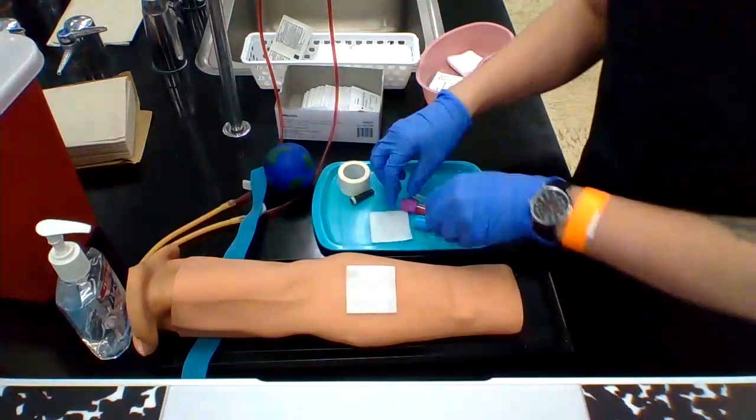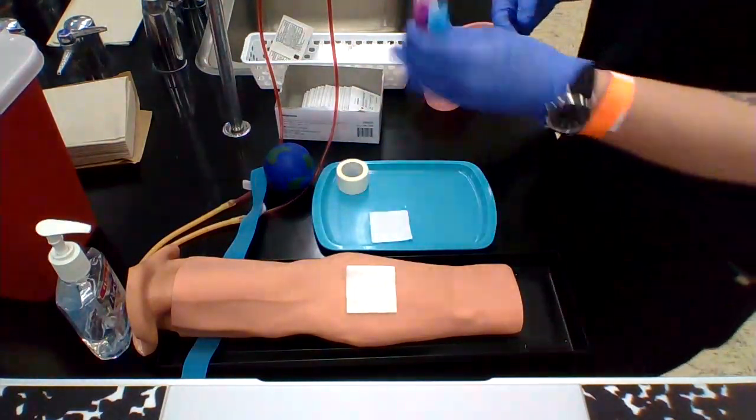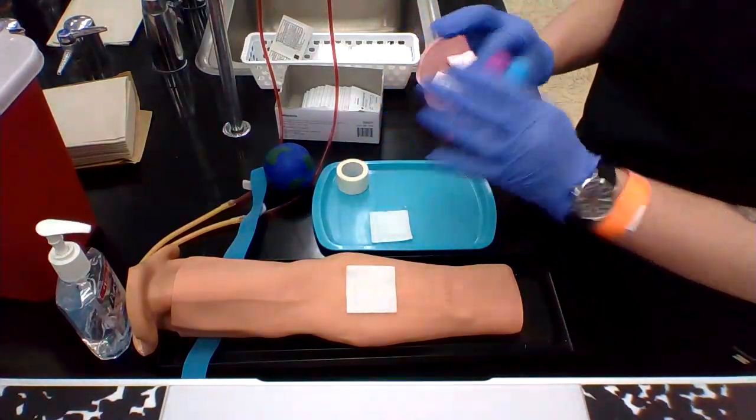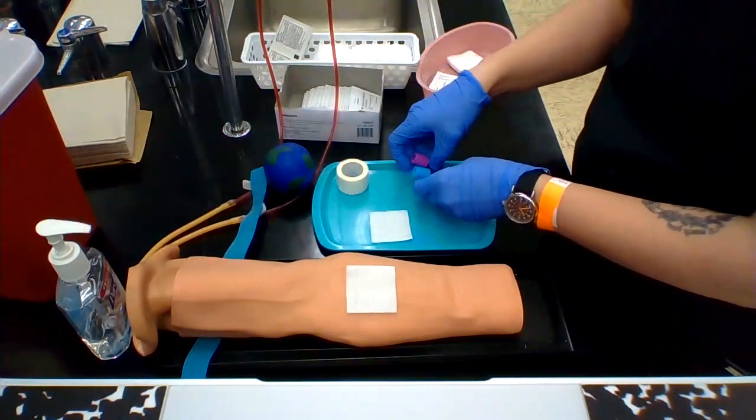Ask your patient to hold that. Invert your tubes about eight times. Label it. Check it with the patient. Put aside for processing later.